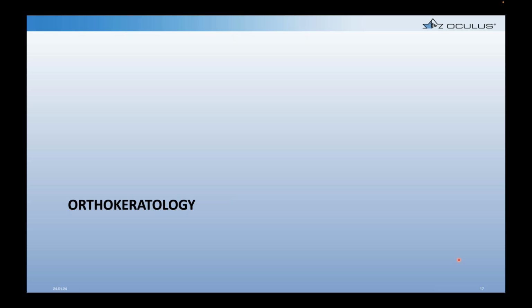And so now in our practice, we do also use our Pentacam as well as our placido disc topographer, both for our ortho-K patients, because you never know when you're going to want to have one view or another. But having that Pentacam at baseline, again, allows us to be much more efficient with our first lens fits as we use that data to create the best possible lens for our patients.